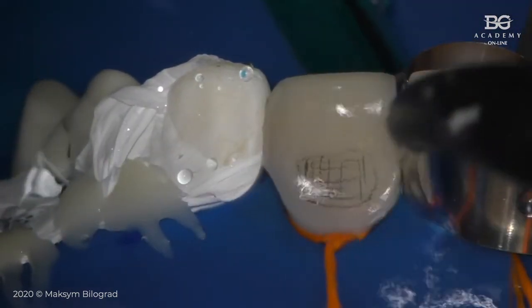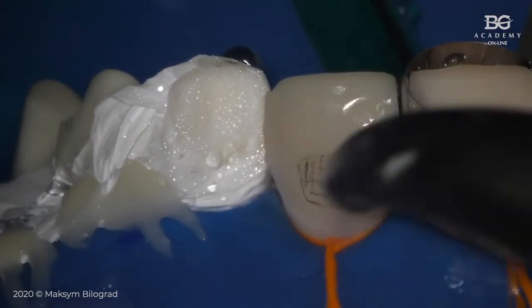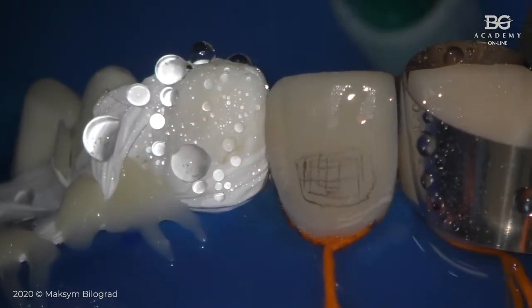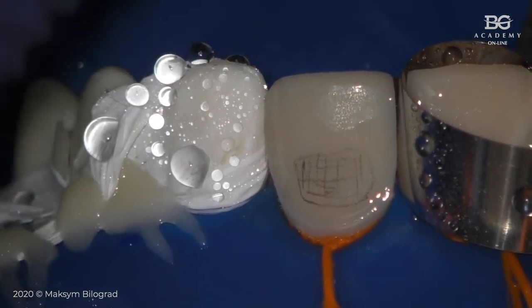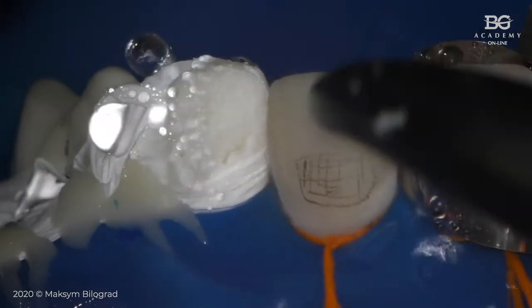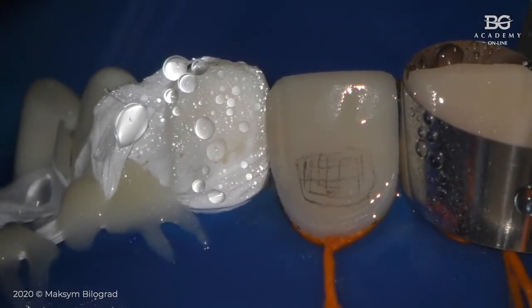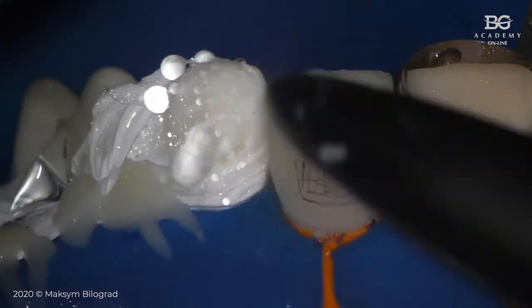Why am I doing the same as during the second option when we have exposed dentin? Why am I doing the same here, even though I have filling? The problem is that if you have filling and some ideas, once you have made sandblasting, theoretically and also practically, you can re-expose dentin again.